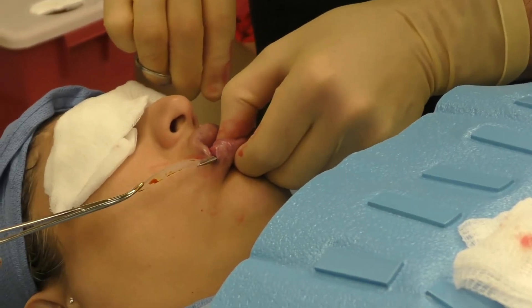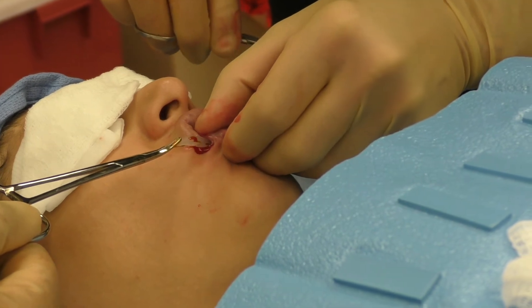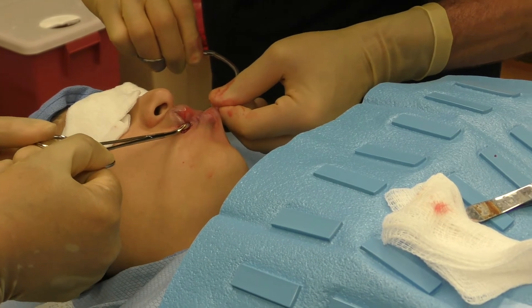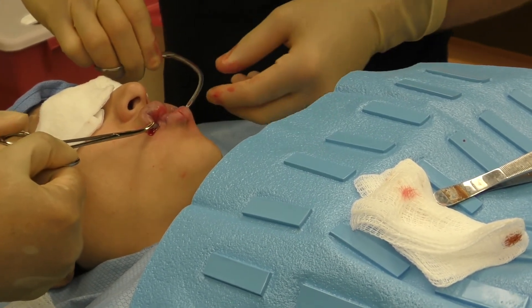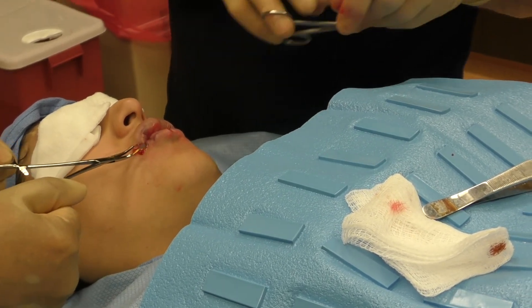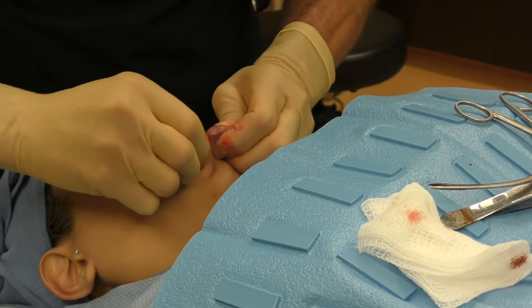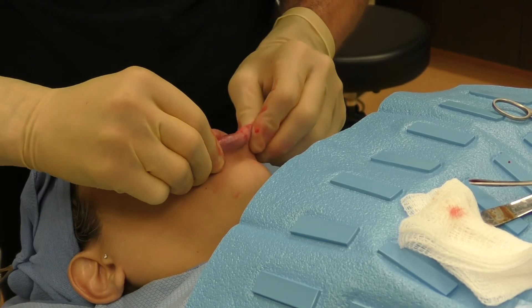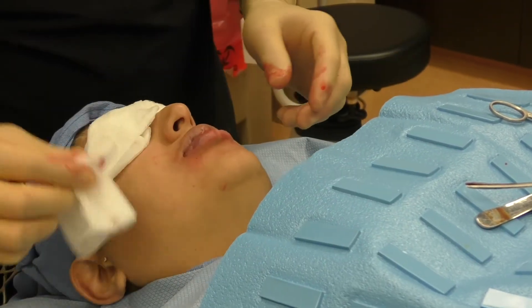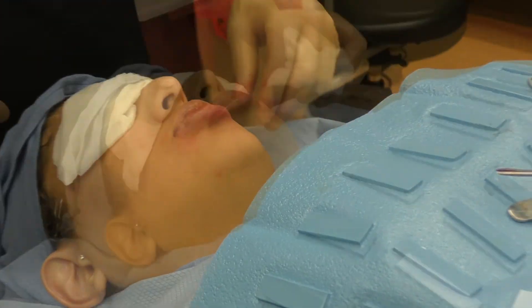Here we have the implant and we just need to drag it through now. I'll make sure it's nice and centered on both sides and then let go — my assistant will let go as well — and it'll just kind of disappear into there. Then from there you can massage it into place as needed. There's the lower lip done, and we'll do the same for the upper lip.